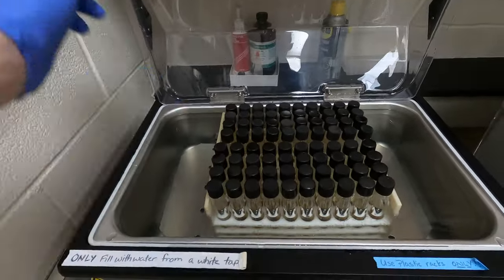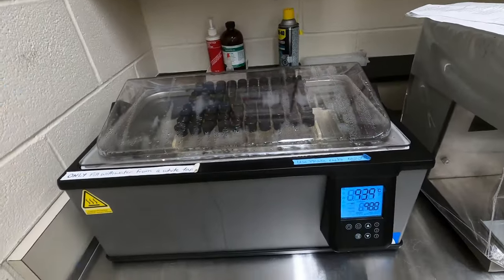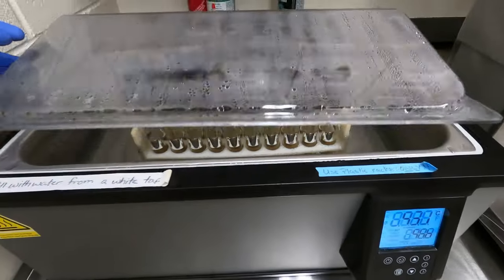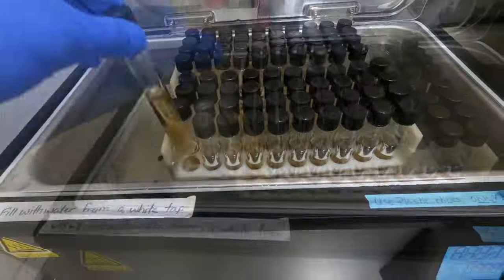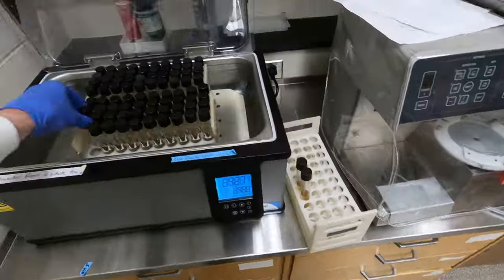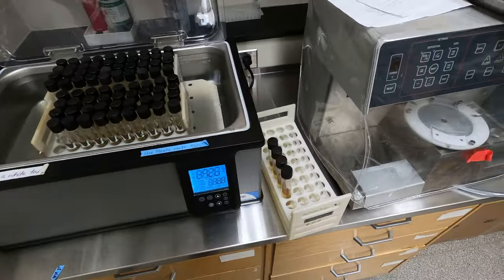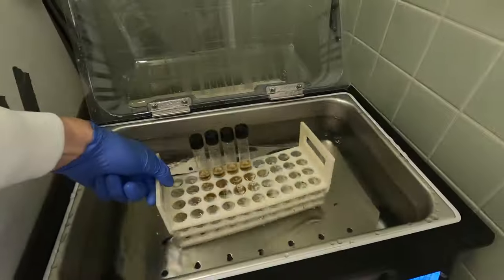We prepare 18 milliliter Mueller-Hinton tubes in advance, and at this stage we melt them in a boiling water bath between 95 and 100 degrees celsius. Once these tubes have melted, we transfer them into a 50 degree water bath so that they can cool to the point where we're able to work with them.